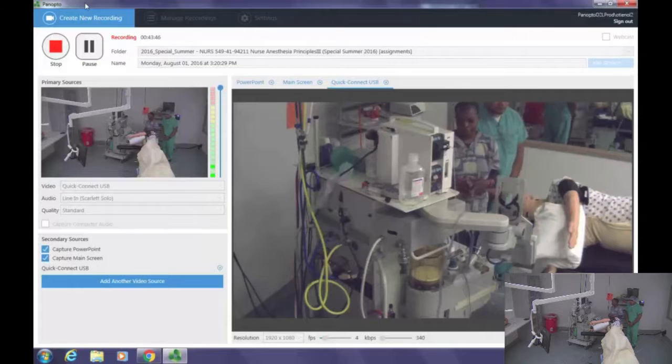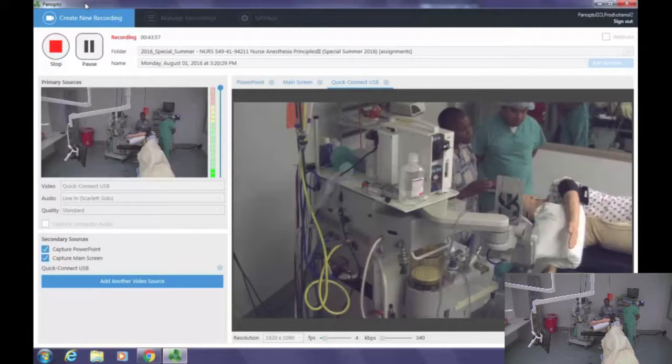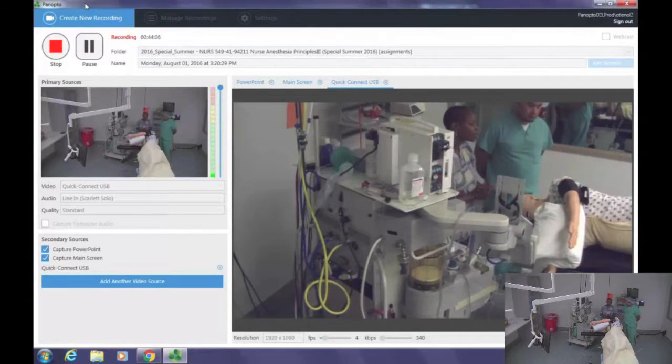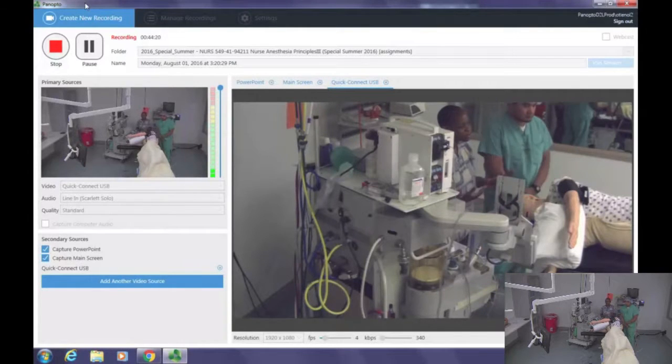Now, the next thing we're going to talk about is the monitoring. We're going to use standard monitoring. We talked about an arterial line, which is necessary in our situation. We are not going to use a CVP and a PA line. The patient needs a Foley, so we're going to be monitoring output. We're going to talk about fluid and electrolytes at this point. The patient has two peripheral IVs, a large 18 gauge and 16 gauge, one on each arm. We need normal saline or LR, and we're using lactated Ringer's at this point.